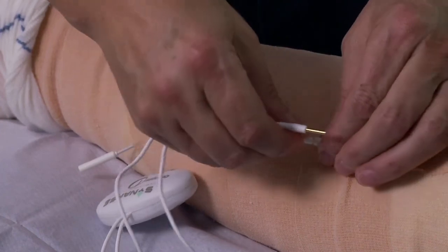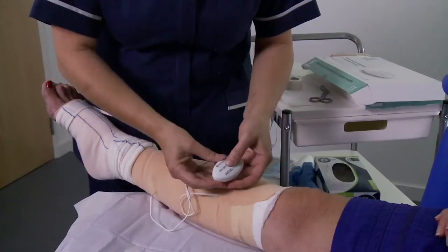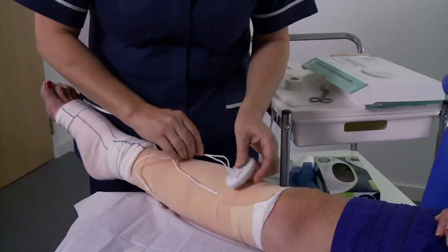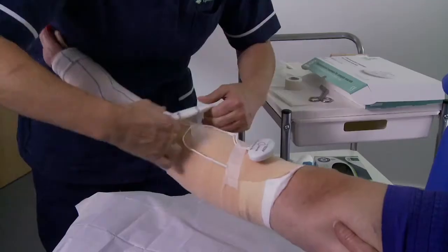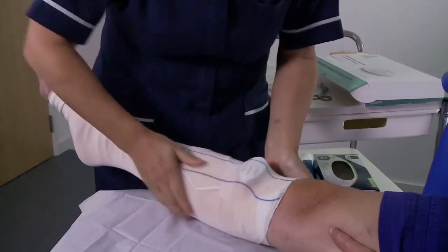Connect the treatment device to the electrode pads by pushing the electrode connectors into the electrode pad receptors. Activate the treatment by holding the on/off button down for two seconds. Continue to apply the tubular bandage to cover the whole dressing and tuck the device securely in place.